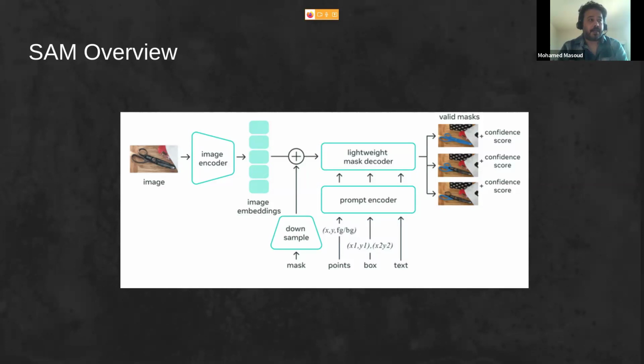Internally they don't discuss this a lot, but the image encoder basically uses a masked autoencoder. This part can help in getting better performance, or can indirectly help with ambiguous objects, where part of the object is not complete.